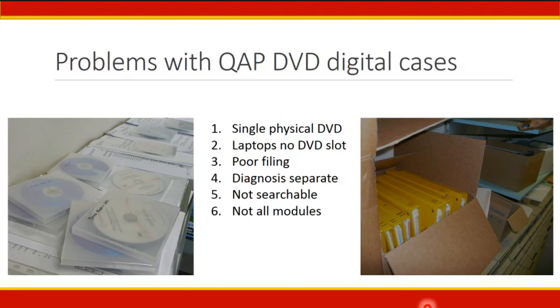If I do happen to find the DVD and the diagnosis sheet, I can't use my laptop computer to study from at home or on the train because my laptop has no DVD slot. Say I want to focus on inflammatory skin. I can't filter by process such as non-neoplastic or even by diagnosis.